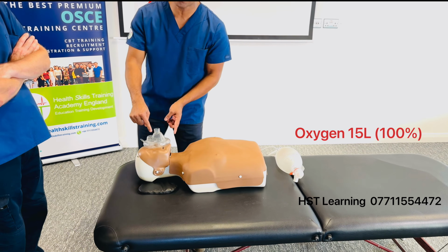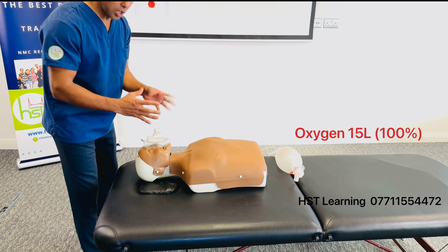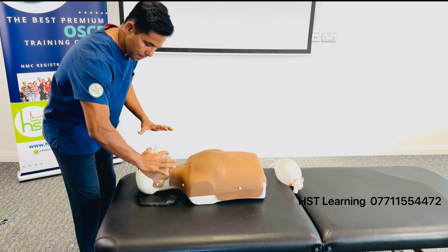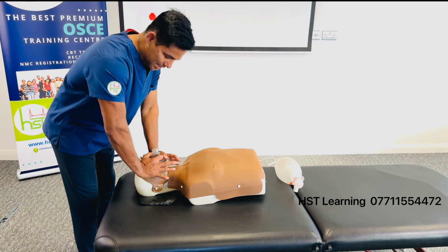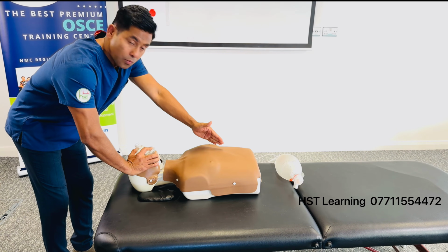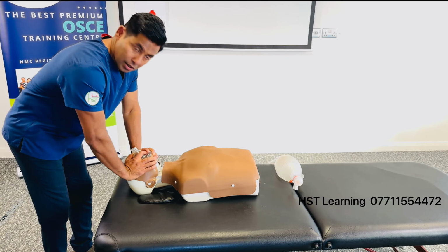Once the mask is the right way around, how do you hold it? People struggle holding the mask, but in the exam situation, your assessor might be holding it for you. Make sure you hold it like a C, with a C on top and another finger in a C cup. Press it nicely and tilt the head back. Tilting is very critical, otherwise you won't be able to give the ventilation. The ventilation might go to the tummy, which is the abdomen. So make sure you tilt the head back nicely.